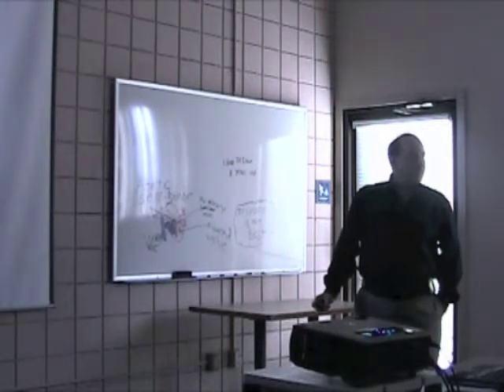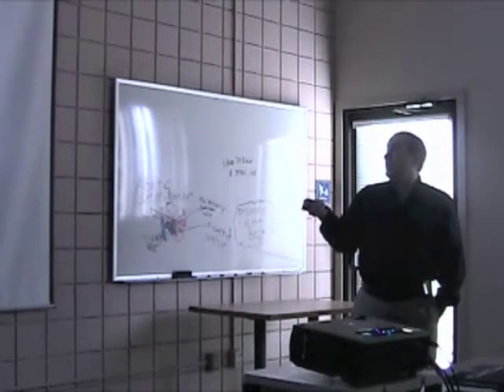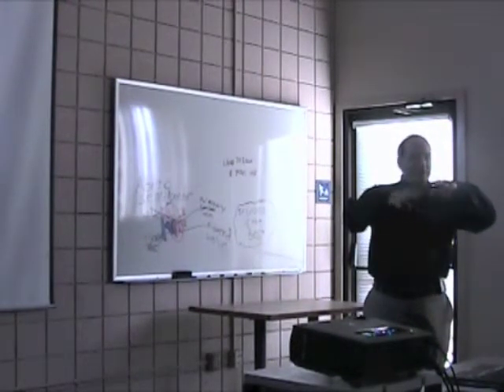While they're doing that operation, how is the heart? Did you take the person off the heart? You don't count on the heart to pump the blood? Correct, that's right. So there are cannulas going in. The blood is going into the aorta up above here. They'll show it to you a little bit later. There's a clamp on the aorta, so there's no blood flowing through the heart.